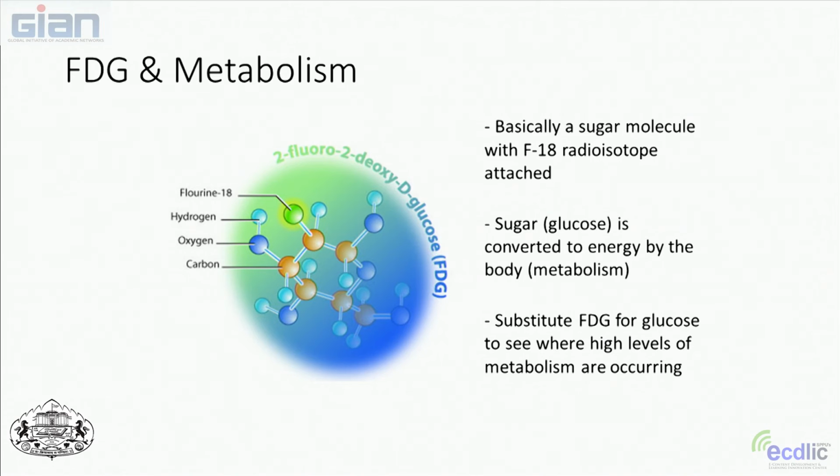And this is one reason why you can study cancer, because cancer occurs when cells are very rapidly dividing, and to do this they use a lot of energy. So PET scans are sometimes used to determine where there's active cancer in the body, and they do this by injecting and seeing which parts of the body are eating up this glucose the most quickly.